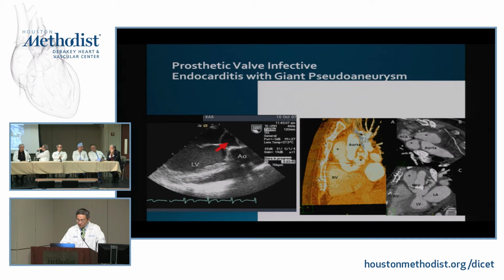You have quite a bit of artifact here from the prosthesis itself. Can you modulate that depending on the acquisition parameters? Because then we get into trouble again of being able to identify motion as well as mechanism. It's absolutely right on, and the major challenge of the CT.